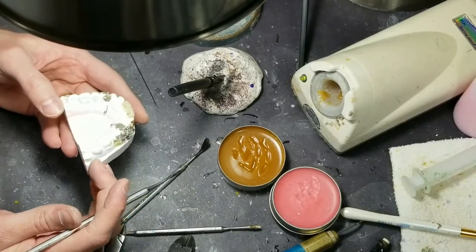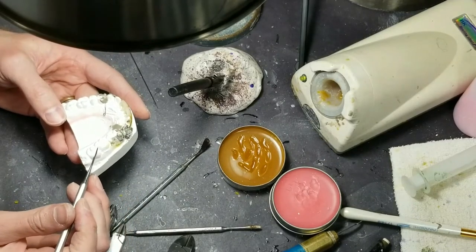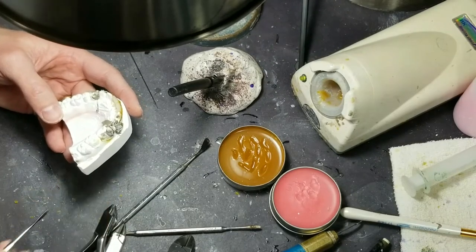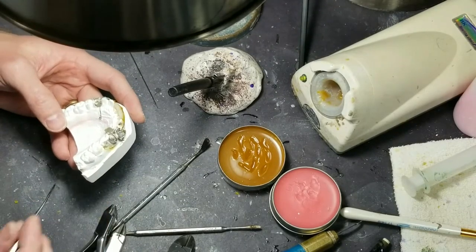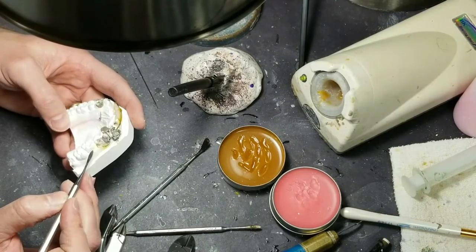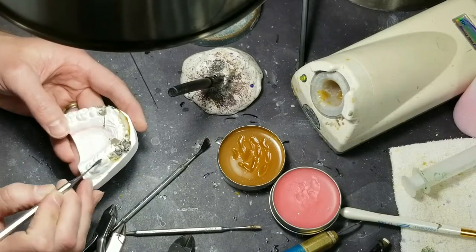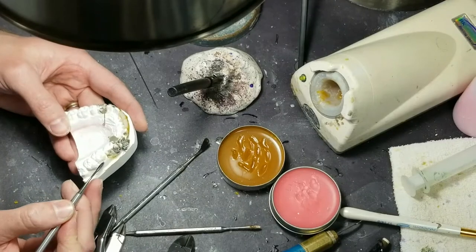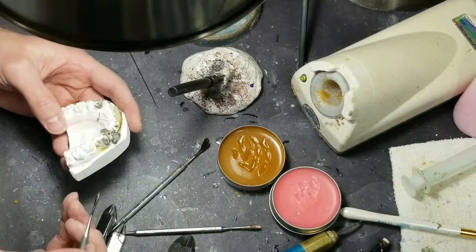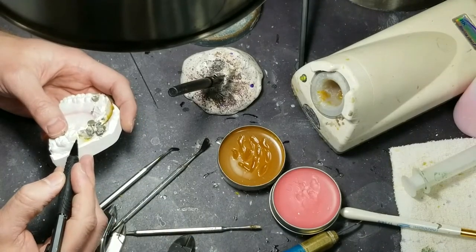What I would suggest — what I've done before with problem patients — is the doctor will put bands on with an attachment, and I'll bend a wire that engages that bracket. So it can pull up against the bracket. I've also done Adam's clasp — I have a video on Adam's clasp — which is a bar that engages the tooth here and here.